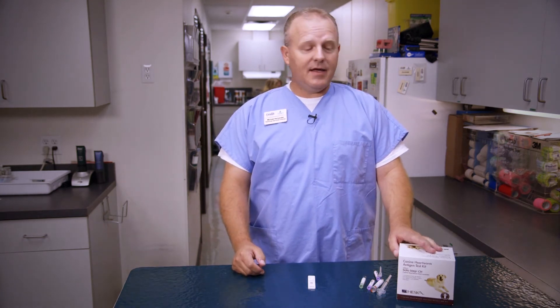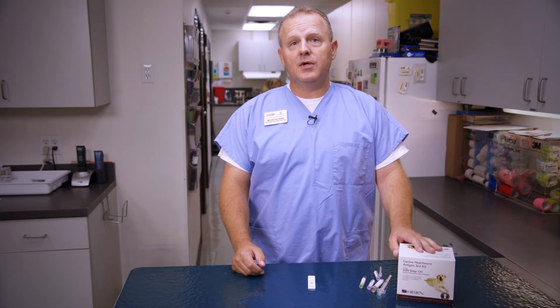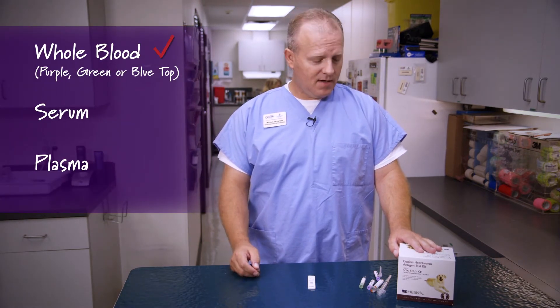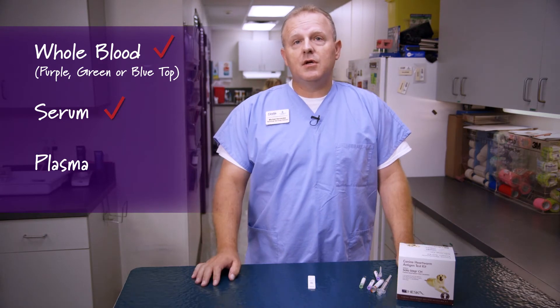You can use either any kind of anticoagulated blood, so whether you're using your purple top or your green top, either one works just fine. You can also use serum or plasma. The best part about using serum and plasma is it's a little quicker — about 5 minutes versus 10 if you're using whole blood.